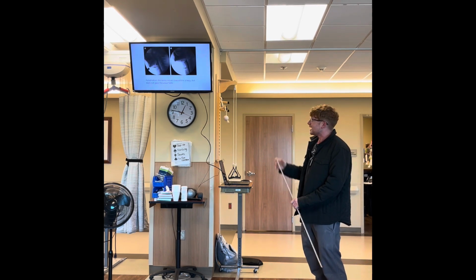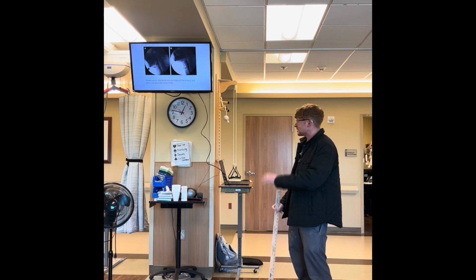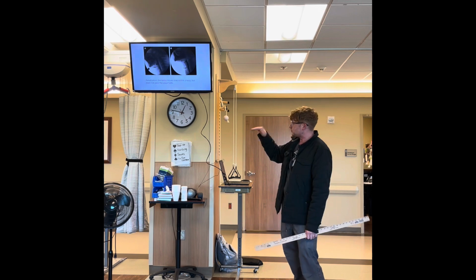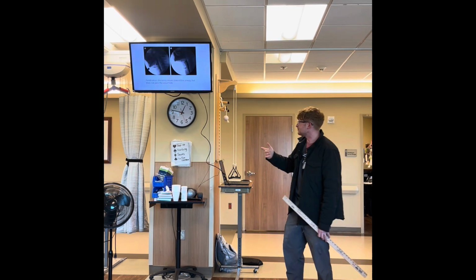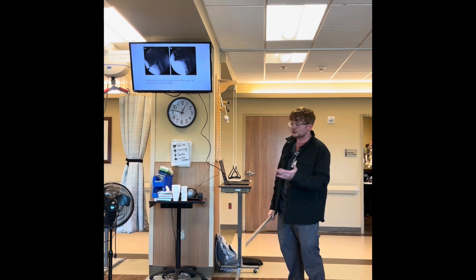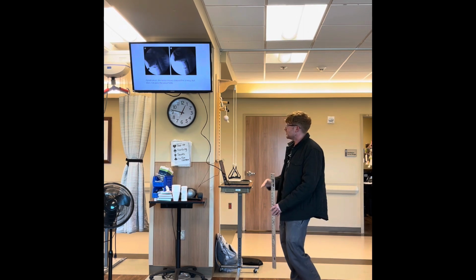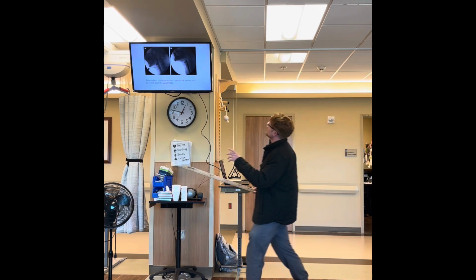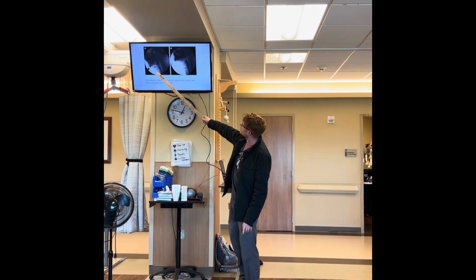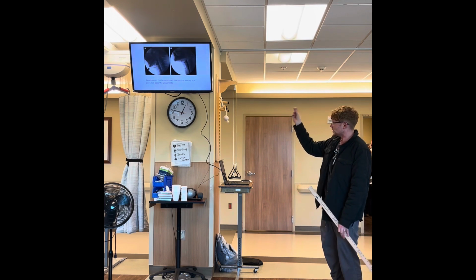So not concerning to a certain age range. Sometimes that's within the normal limits. But if it's frequent and there's a lot of residue left behind, we still may recommend things depending on the depth and other factors like age and so forth. It moves toward the airway, but it doesn't pass the vocal folds, which in this image, your vocal folds would be right here. Kind of hard to visualize them. It's really just a shading more than anything, but it's just on the top of your airway.